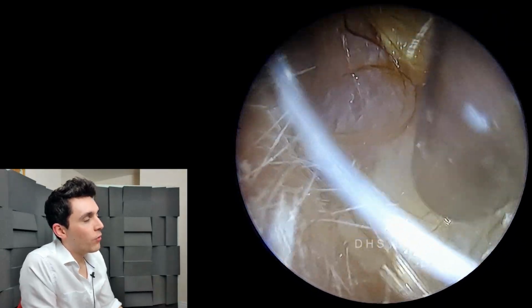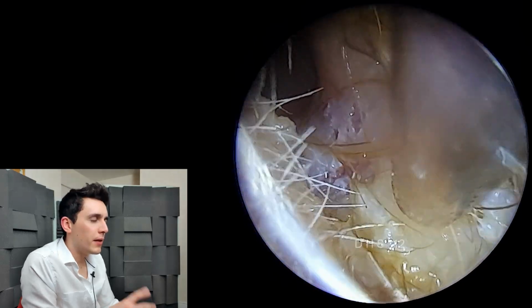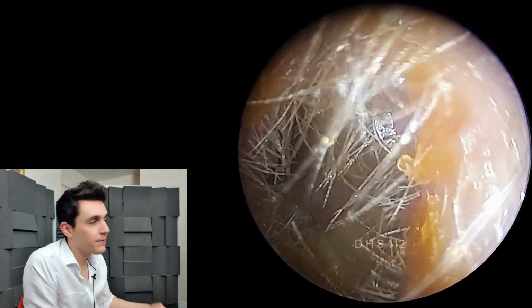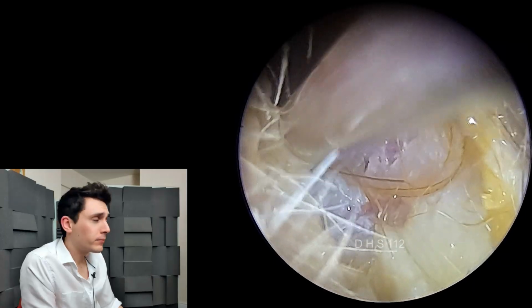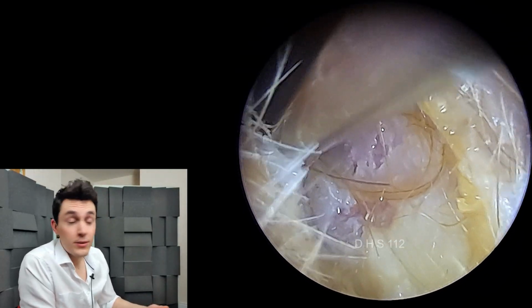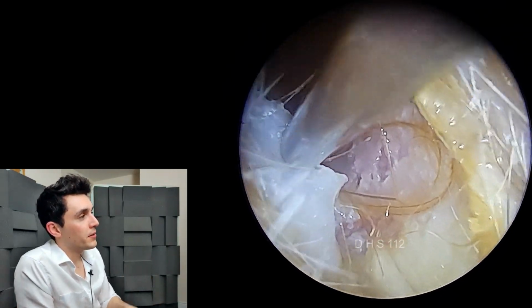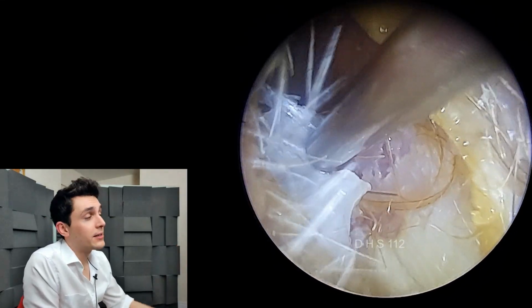And then he said, oh, and also my ear was getting wet, like it would just be wet for ages. And then I'm thinking, okay. So I asked him, does that wetness have an odor? And he said, yes, it did. So immediately I thought, okay, there's been an ear infection. He said that was several weeks ago. So he didn't go to the doctor. He just tolerated it until it cleared up. But as soon as he said that, I thought, right, this is going to be a suction job. There's going to be loads of dead skin to clear out. And of course there is.